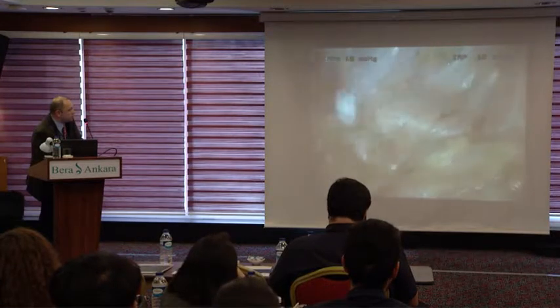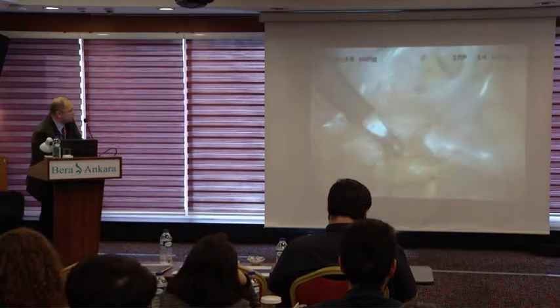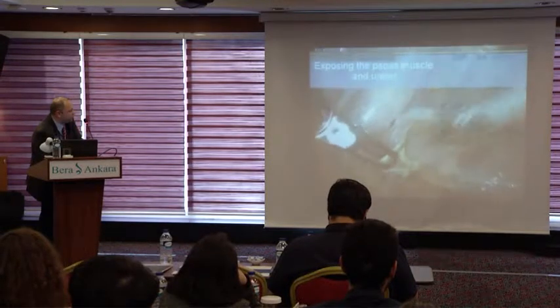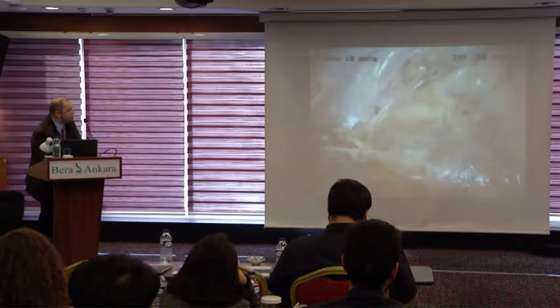The psoas muscle is exposed. You will see the muscle of psoas. Then you are sure that you deflect the colon to avoid intestinal complications. You have to medialize the colon.